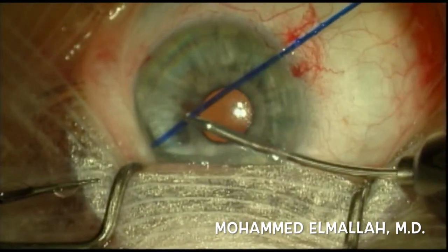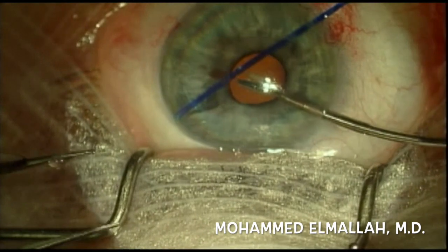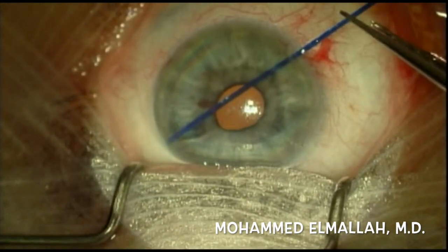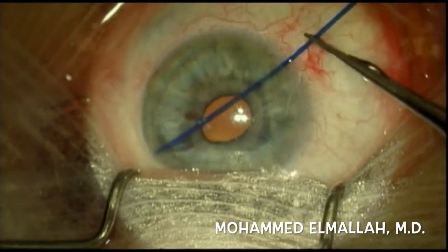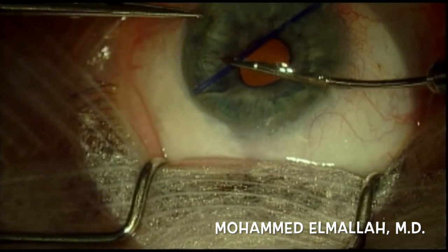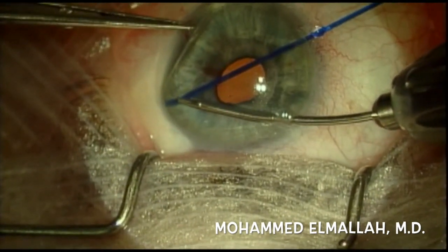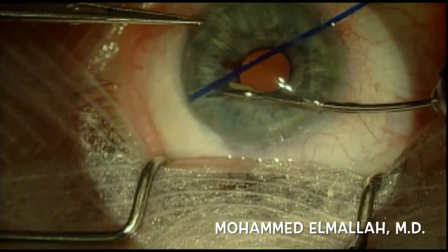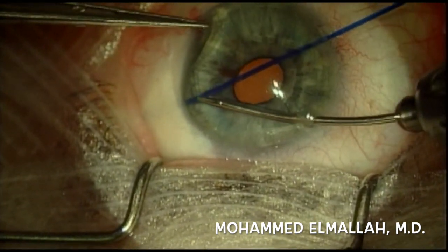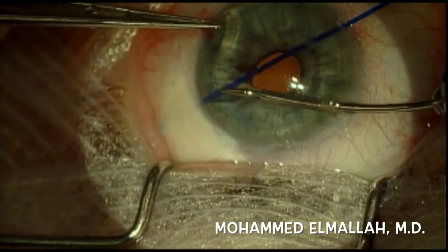A piece of 2-0 prolene suture was trimmed with a bevel and introduced through the paracentesis across from the tube. MST micrograspers were used to facilitate placement of the 2-0 prolene suture into the tube, and then the suture was slowly worked up the tube using .12 forceps as counter-traction.